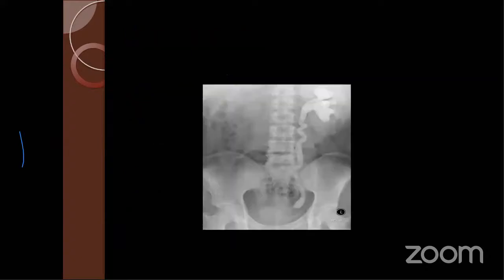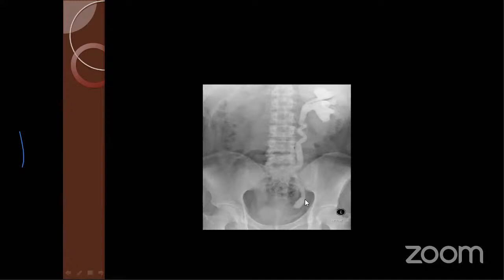Looking at IVU pictures: one case shows right renal agenesis with compensatory hypertrophy and dilatation and tortuosity on the left side — right agenesis of the kidney. Another case shows horseshoe kidney — the poles are fused in front of the vertebral body. On IVU, the poles appear fused, forming a horseshoe shape, and the ureters are medially displaced. You need to see multiple X-rays to properly appreciate these findings.